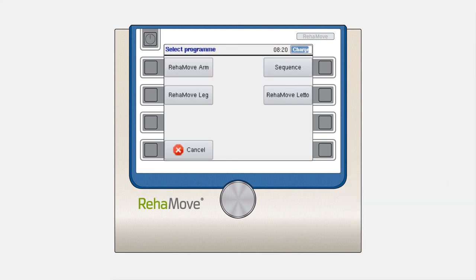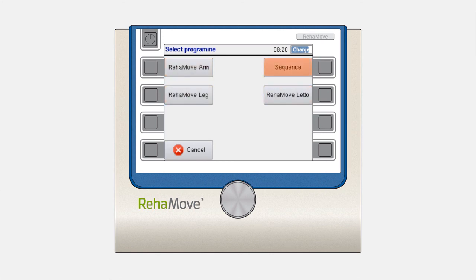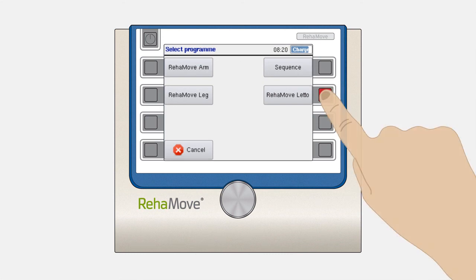The next window will show you your training program options depending on the type of licenses you have purchased. You can choose between the programs RehaMove Arm, RehaMove Leg, RehaMove Letto, and Sequence Training. Programs which are not licensed are greyed out. Choose the program you need with the corresponding button.